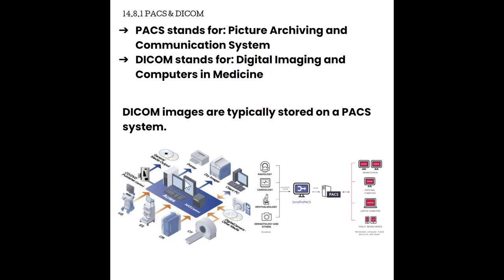Once they're in the PACS system, the radiologist can access them, the cardiologist can access them, and they can create a report based on the images that got sent to PACS. You as a sonographer can go back to another computer and review your images. And the nice part about this is we're not making films of these that need to be stored somewhere. They're not going to get lost. They're not going to fade over time. They're stored digitally in a computer system. It takes up very little space, with very few consequences to using it, really only positives to using the PACS system.